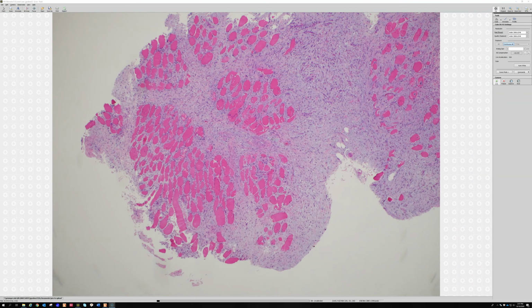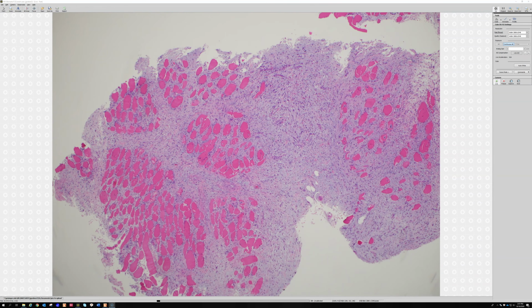So the one clue is that the cells, if you ignore the ganglion-like cells, everything else kind of has a fasciitis look. It's hypocellular, usually. There are exceptions, like that case I mentioned that I had trouble with early in my career. Thankfully nothing bad happened to the patient, and it was a good learning lesson, but it was a little scary. And that was after I had done a soft tissue fellowship. So I still struggle, and I thought about proliferative fasciitis, but I thought just too much.